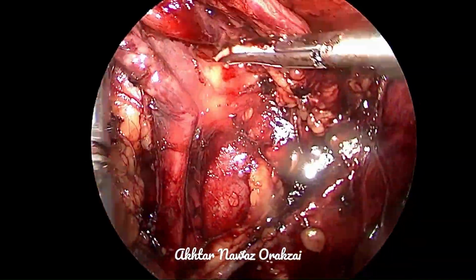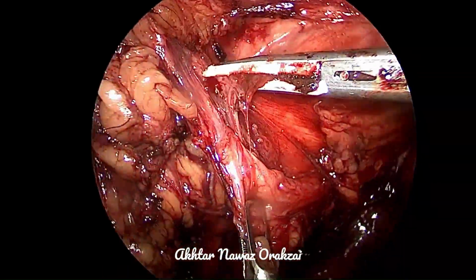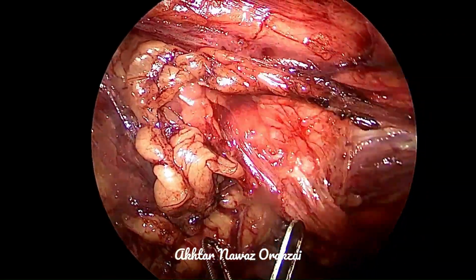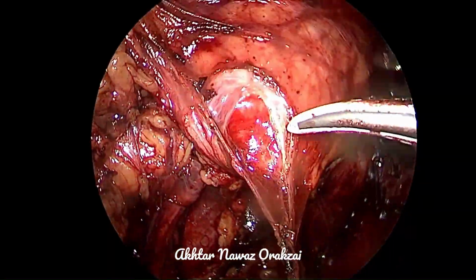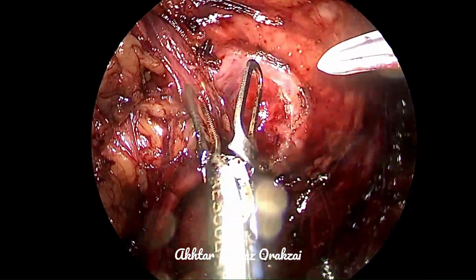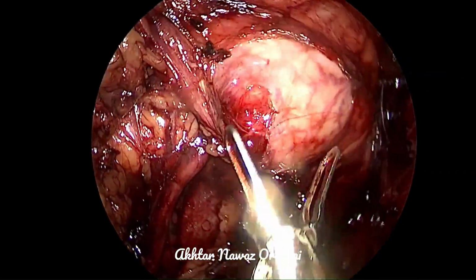Now here you can see that the lower portion is mobilized enough. Now we are mobilizing the pelvis away from the vessels. As you can see, the peripelvic tissue is getting dissected away.